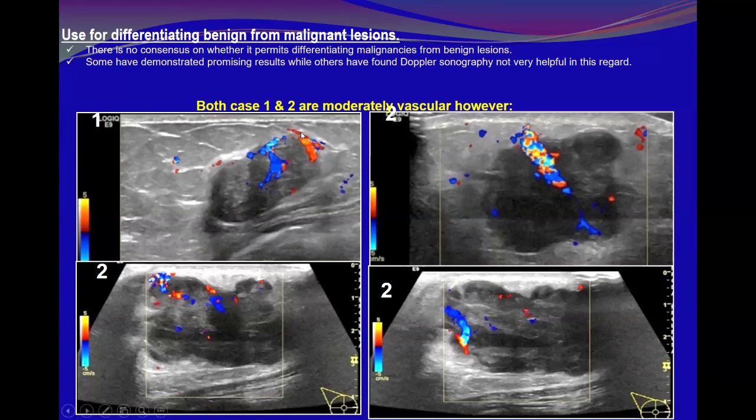And we said that if you look here, this is a marginal vessel, okay? And this is a branch of which, in blue, and this is in red, okay? But it simulates the native vessels, okay?